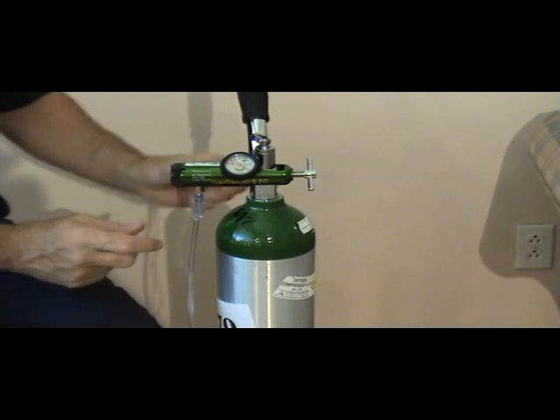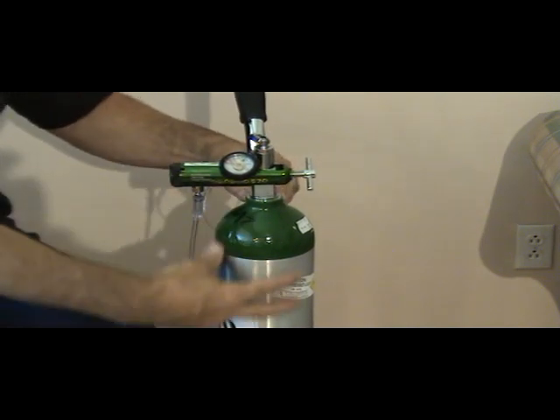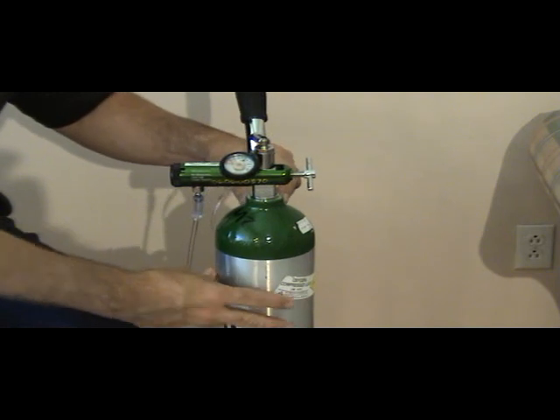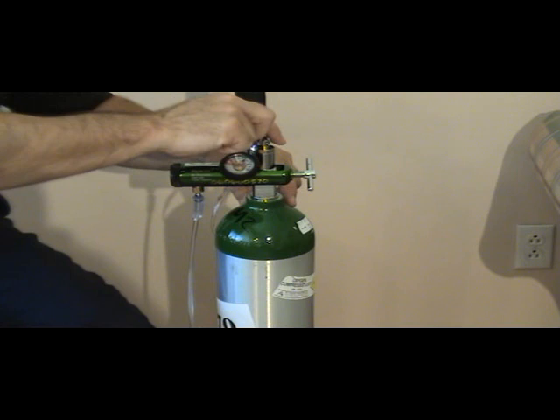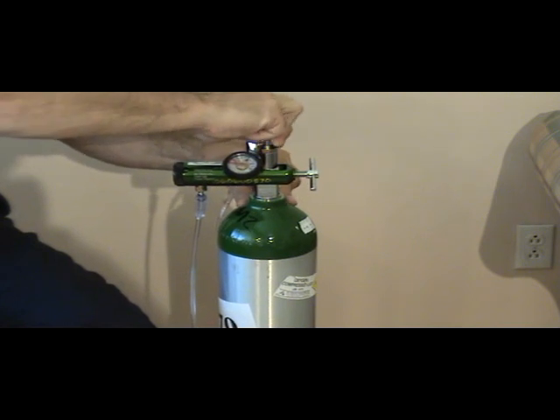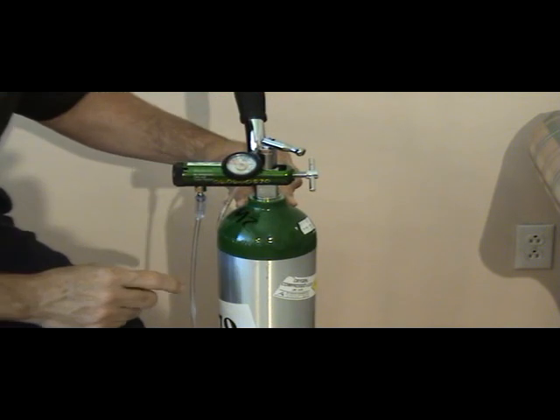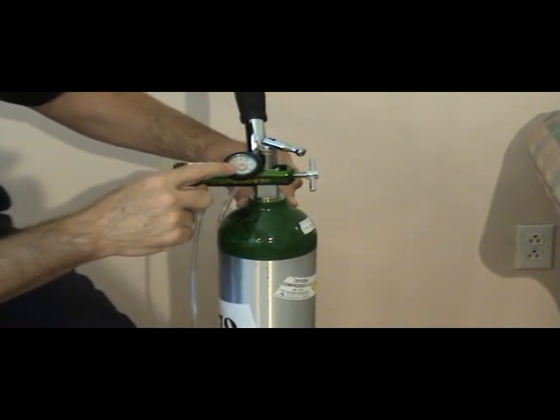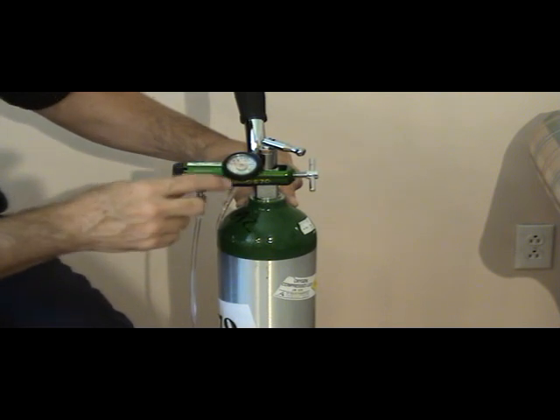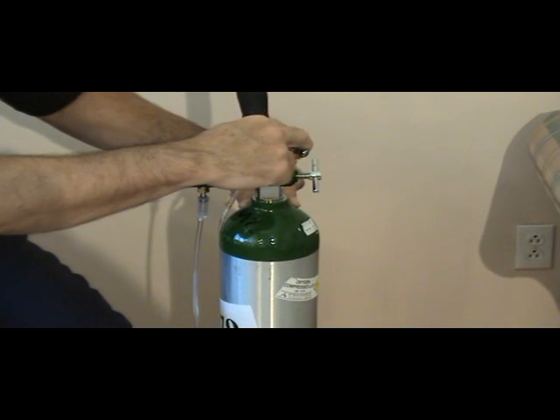Now to make this as easy as possible to use in the home, what I always suggest is, instead of turning both of these off, remember that there's a limited amount of supply of oxygen in this tank. So when you're not using it, make sure that this is turned to the off position. So what we do is we turn this clockwise until we can't turn it anymore. When you do that, if you were to look at the gauge, you would see it slowly going down to 0. This lets you know that the air is contained in the tank.